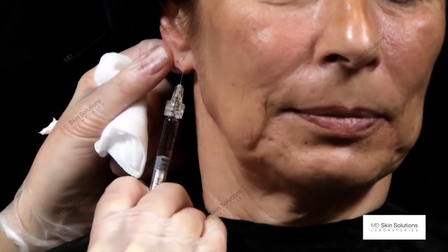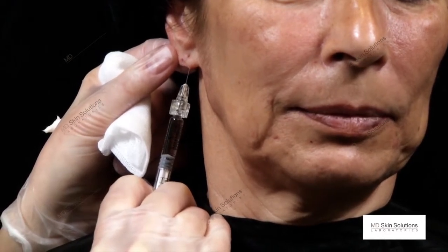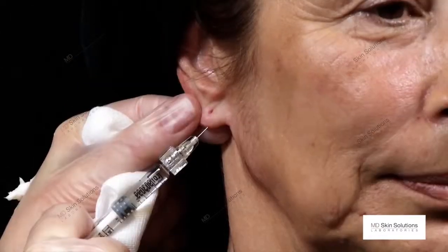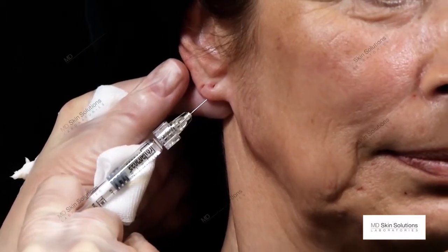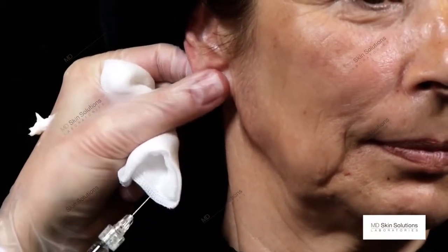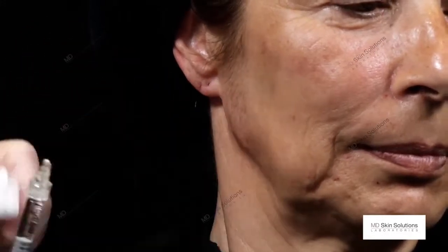I use a 30 gauge needle. I mix the Pluryal with 20% of lidocaine, reshape, revolumize the earlobe in order to get a younger-looking earlobe and the earrings better holding.